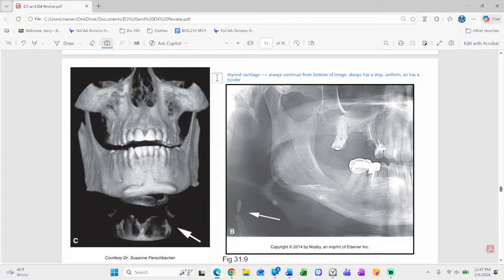What else? I've got epiglottis here, of course, arm of hyoid into body, out the second arm. A little bit of calcification. I'm not sure what. Could it be a tonsillolith? Maybe. Sometimes you'll just get little calcifications in the tissues for whatever reason. Styloid process, normal within the earlobe. Anybody else? Questions about anything else you see here?